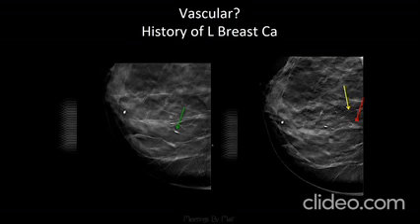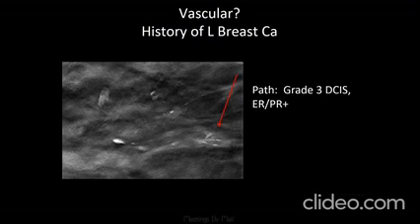So I took her to tomosynthesis for biopsy. Now, I know some people, the very fine calcifications, prefer to do old school 2D stereotactic biopsy. I actually find that tomosynthesis works really well if I do a breath hold on the initial view to see the calcifications, and I actually prefer to biopsy them. Now, in this case, I really wanted to biopsy them under tomosynthesis because I knew that she had some neighboring vascular calcifications, and I wanted to use the tomosynthesis to try to make sure that I was focusing in on the ones that I was worried about rather than the vascular ones.